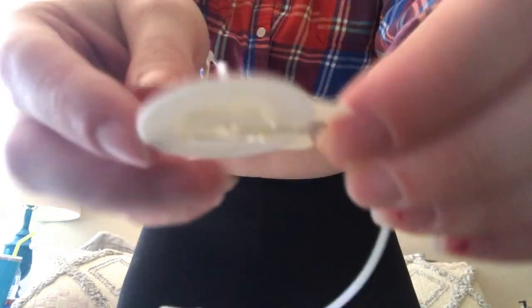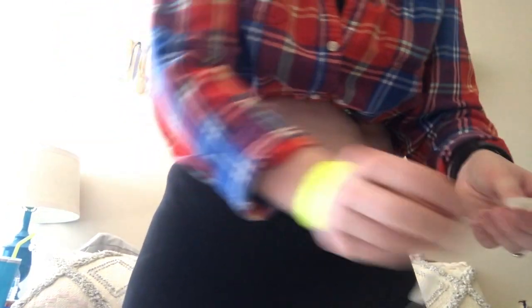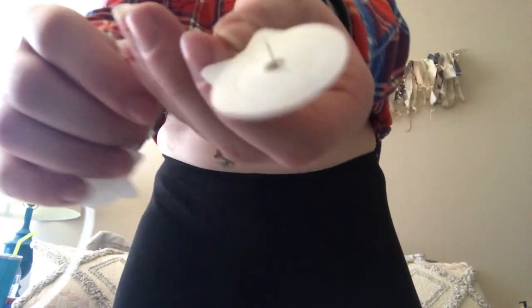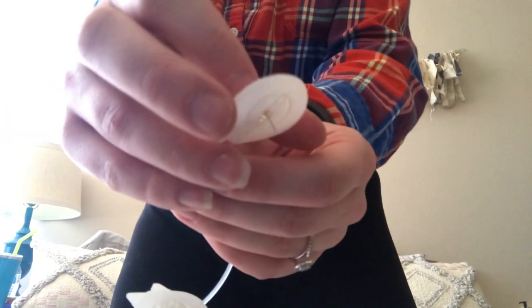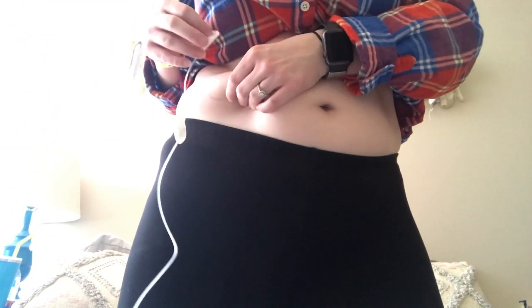This right here is the needle and I'm going to take the protective covering off of it. It has a little two adhesives right here and I'm going to pull each of them off, then pull this back kind of like a butterfly to where it's just the needle, and I'm going to pinch my skin.